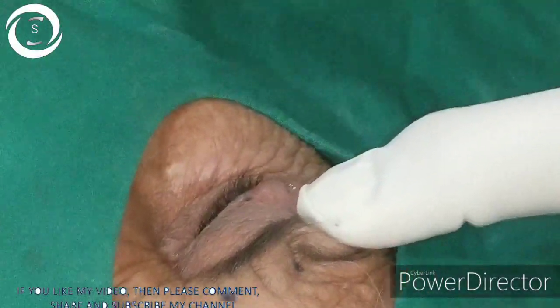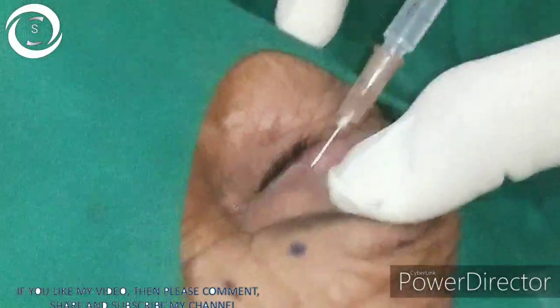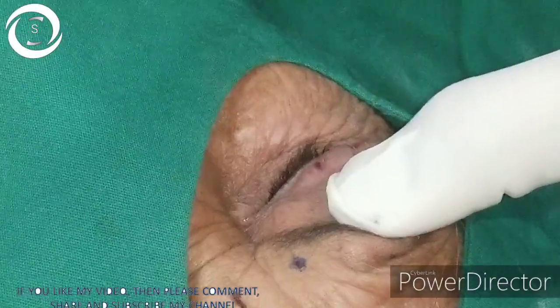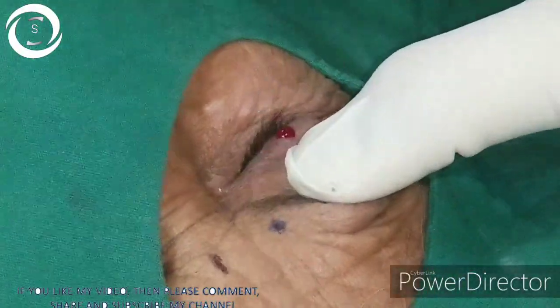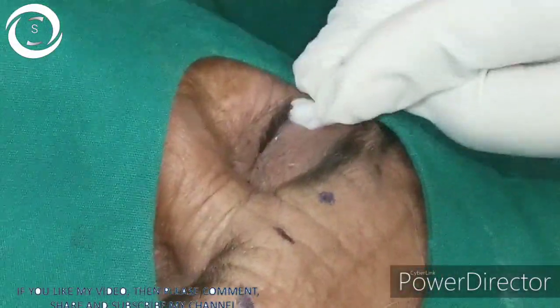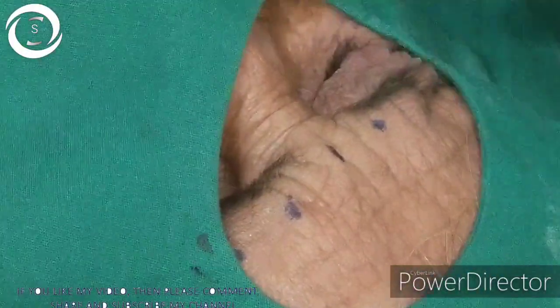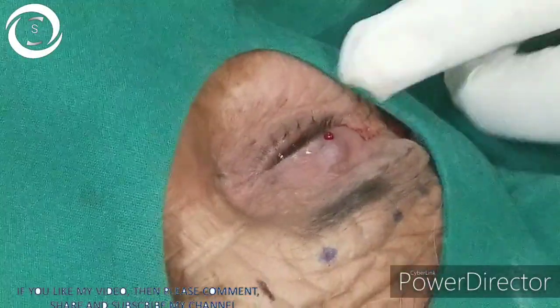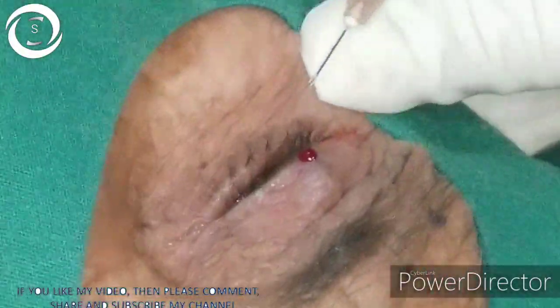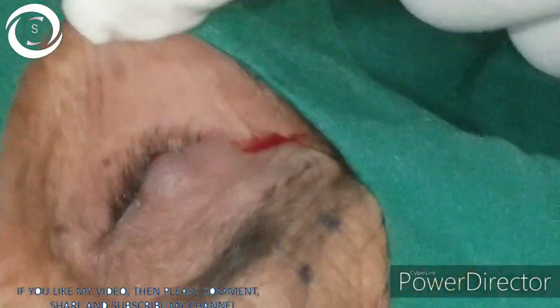Make sure that you are superficial in order to avoid damage to the levator and causing ptosis. Anesthetize the marked areas with lignocaine cream 15 minutes before injection. You can also apply topical anesthetic drops five minutes before injection, or you can proceed without anesthesia. Clean the marked sites with spirit and allow them to dry, because moist alcohol may inactivate the Botox. Make sure you inject subcutaneously and not deep, to avoid ptosis and diplopia, because the orbicularis is just beneath the skin. Ideally, the injected solution should make localized swellings.